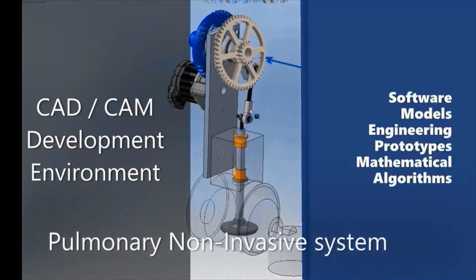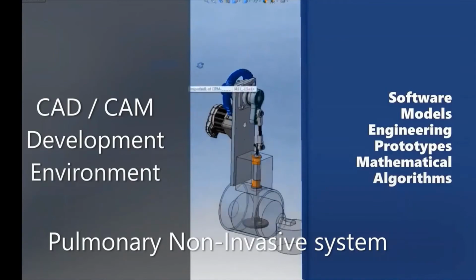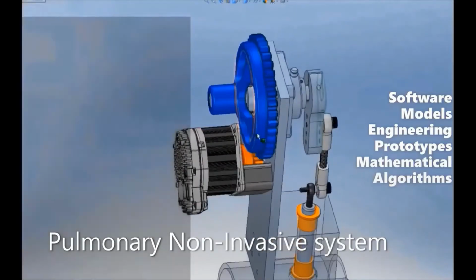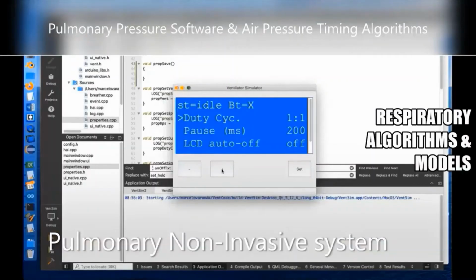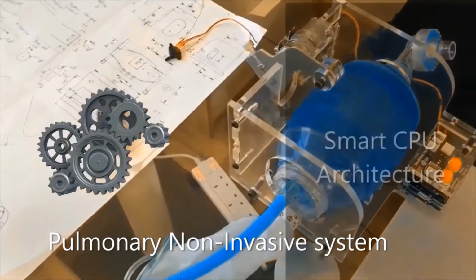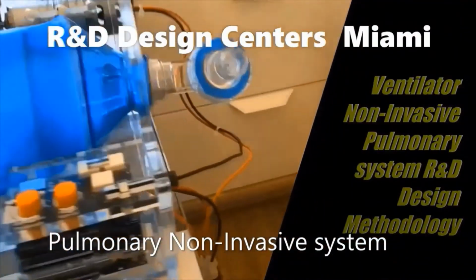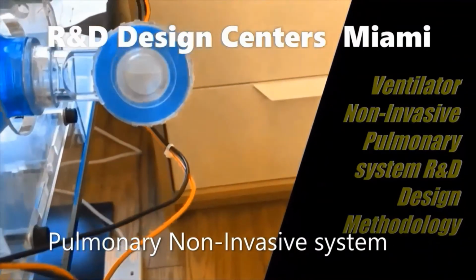Here the smart microcontroller can measure and control the volume and the pressure parameters. The time-based frequency of the system ranges from 5 to 30 breaths per minute.